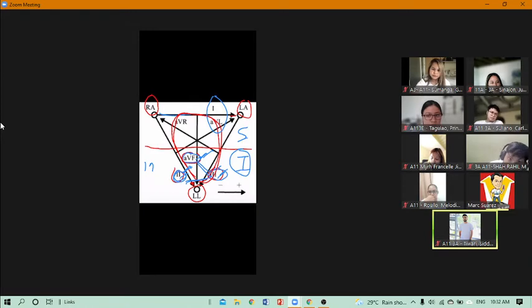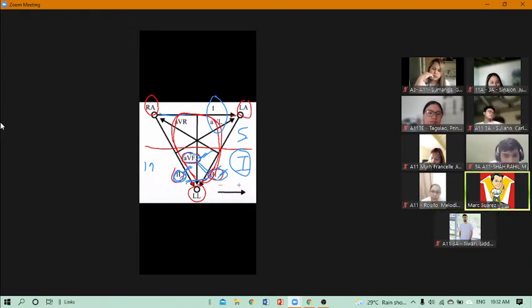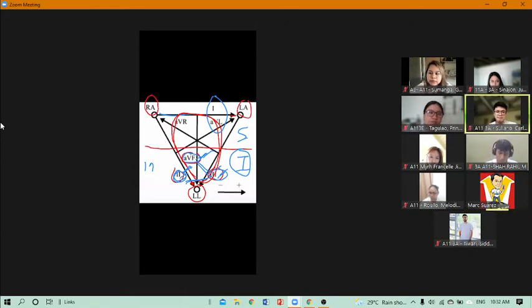Okay. So is the message clear? Yes, Doc. Why are we doing this? I'm just giving you a brief overview since we will be dissecting the subsequent ECG tracings of the case. Does everybody want this process flow, or do you suggest any other? Proceed, Doc. Okay, proceed. Yes, thank you.